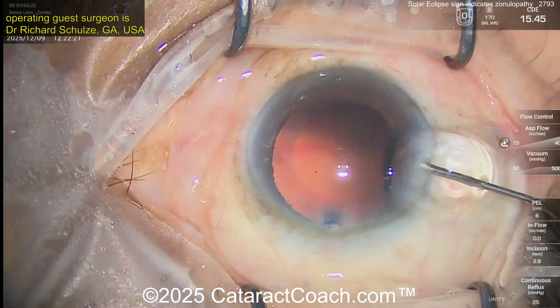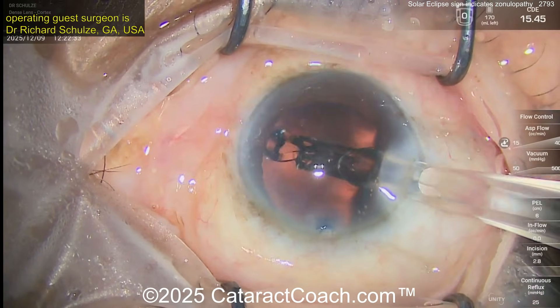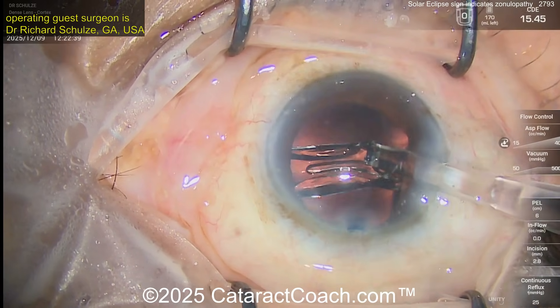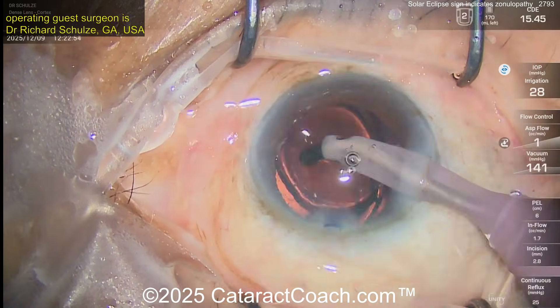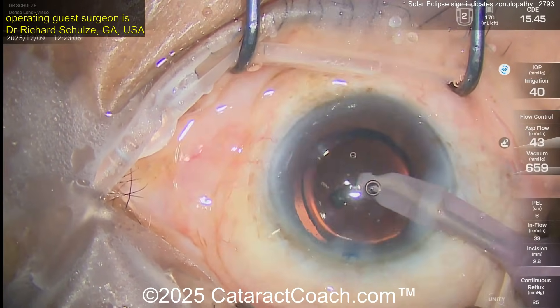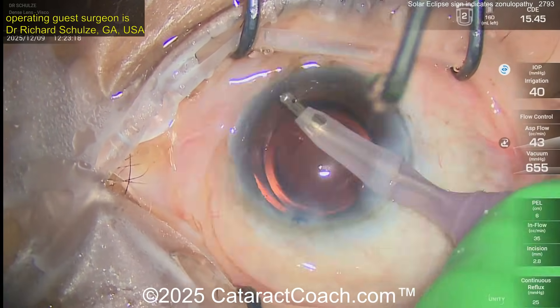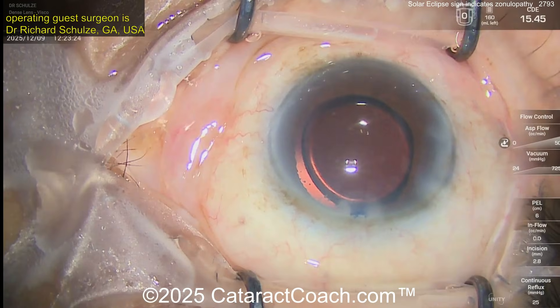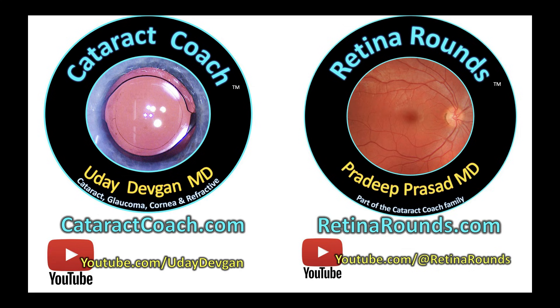Filling the capsular bag — here comes the IOL. That's a nice-looking case, really great. We sped the video up a little bit to be efficient and respect your time as a CataractCoach fan. Again, think about the solar eclipse sign: if you see it, expect zonulopathy in that area, or possibly more widespread. Remember to check out our sister channel retinarounds.com — an amazing resource.